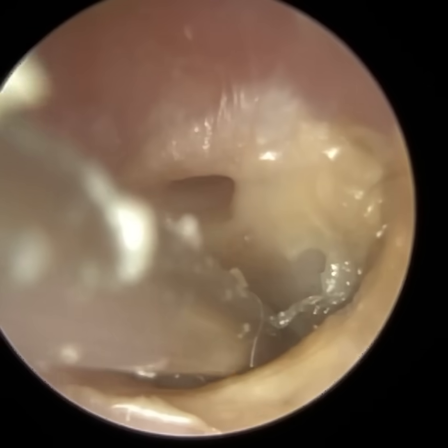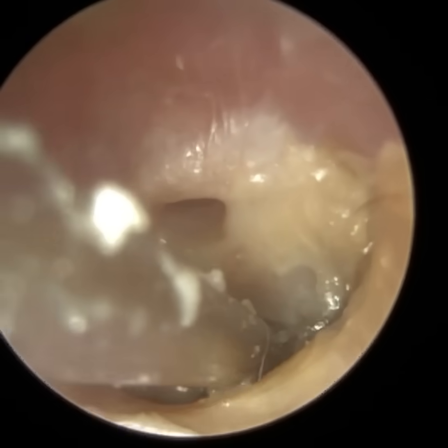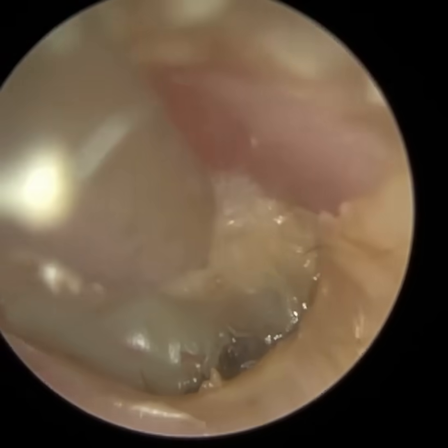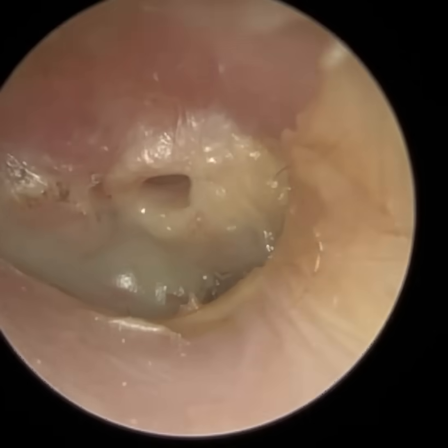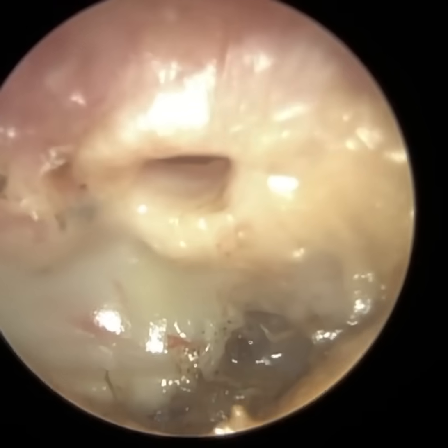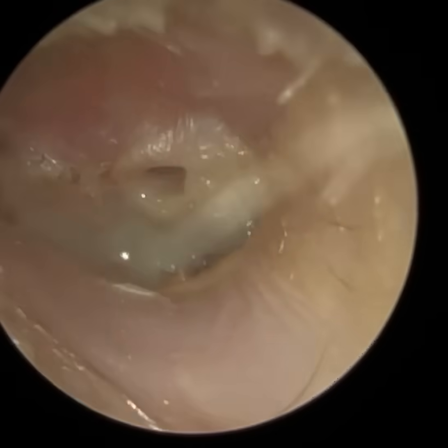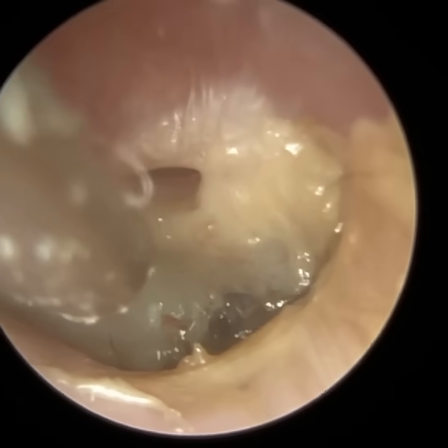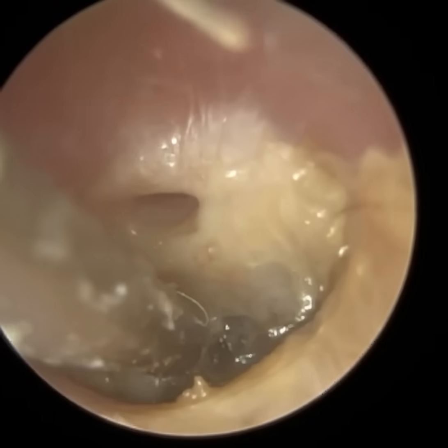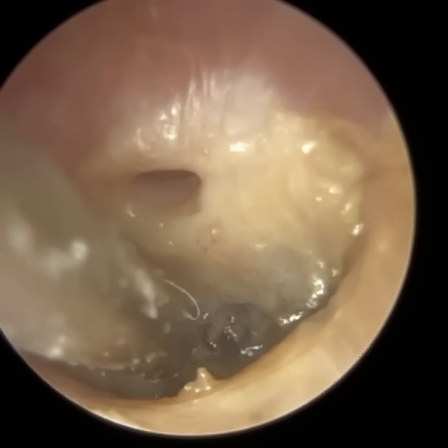When you've got a hole in the eardrum, what can happen, the outer epidermis layer of skin that forms the eardrum, which has got 3 layers, it kind of migrates inwards into the perforation, so it's very difficult for it to then close. So if you make a fresh incision, you can see around the edge of that perforation, it's protruding outwards, and that looks like the skin is kind of on the eardrum as it's migrating, it's curling over that hole and then going inwards, and it's created this little ridge around the periphery of the hole.